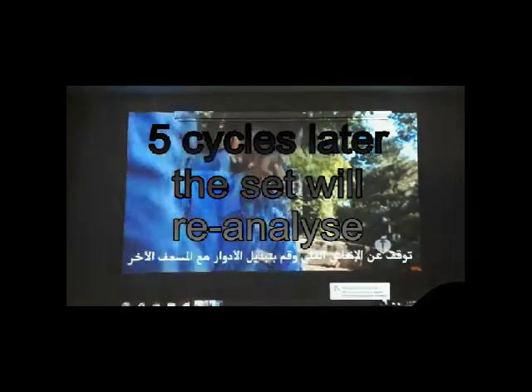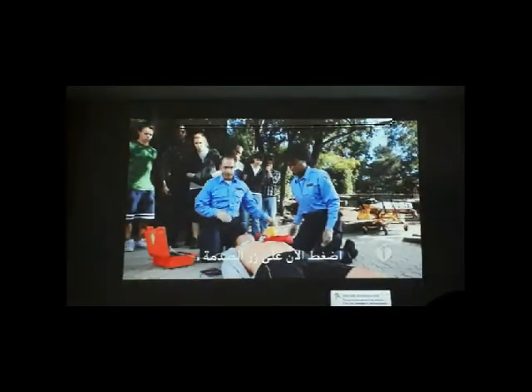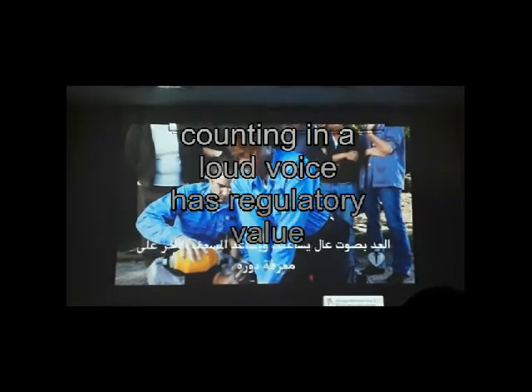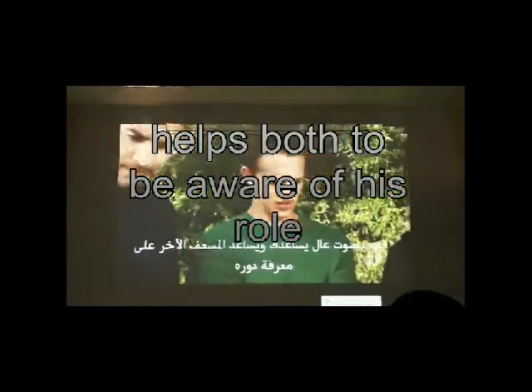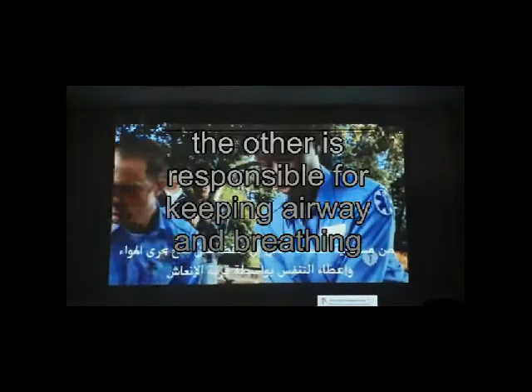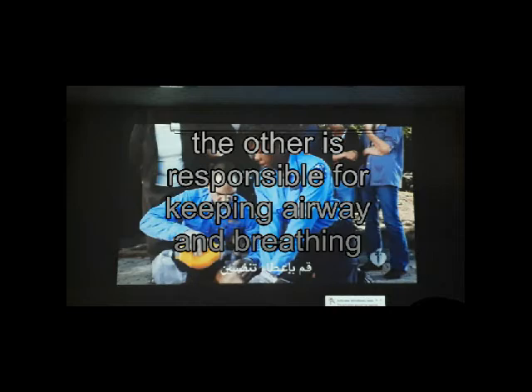Let's switch again. Shock needed. Stay clear of patient. Charging. Press the shock button. Everybody clear? Shock delivered. Begin compressions. 1, 2, 3, 4, 5, 6, 7, 8, 9, 10, up to 30.